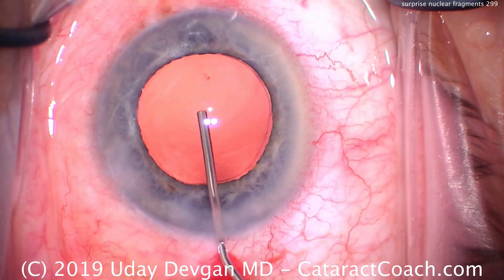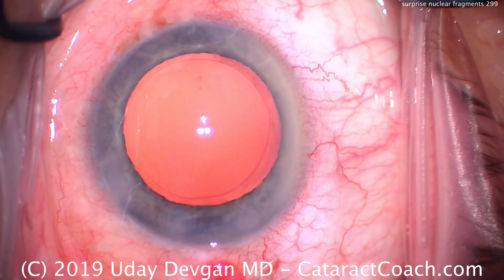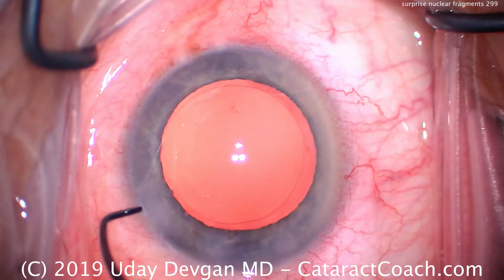Watch this case — otherwise a normal case. The capsular bag is nice and empty. We inflate the eye with viscoelastic and we'll have a nice round rhexis. It looks great.